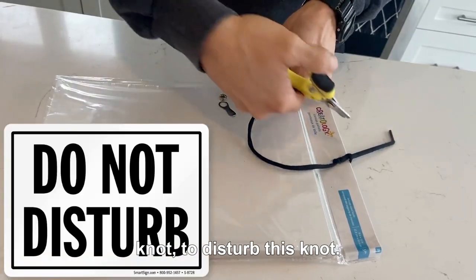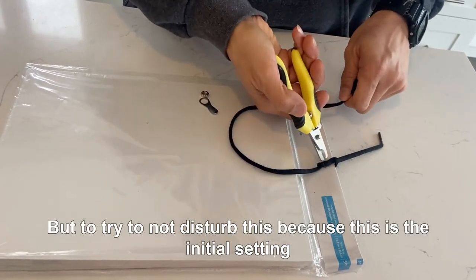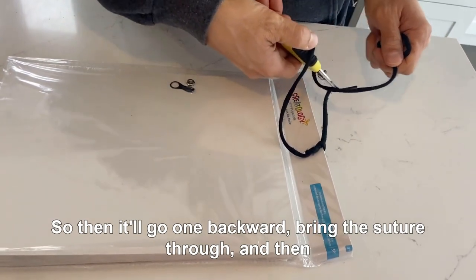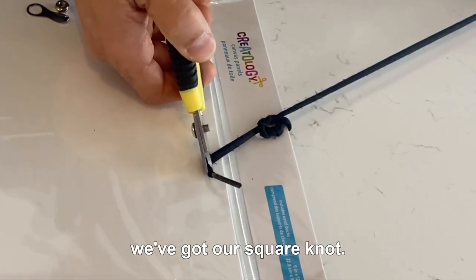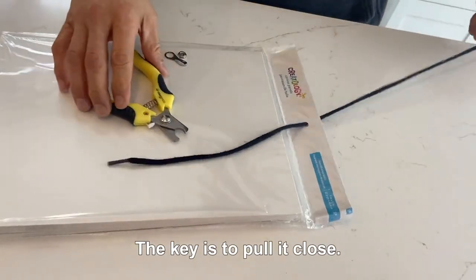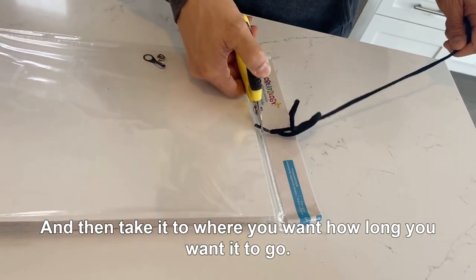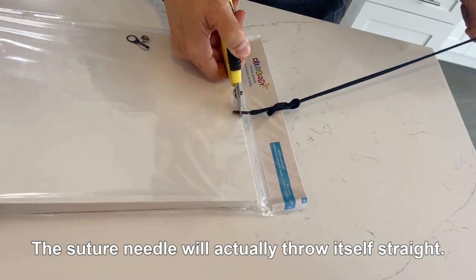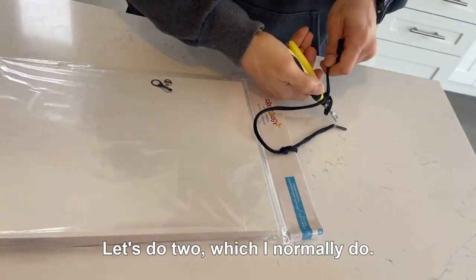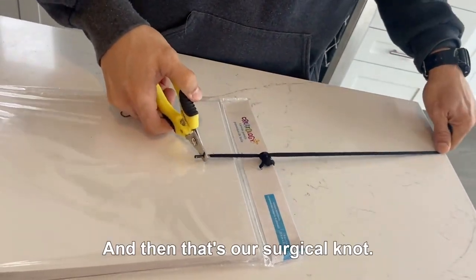What I've noticed is I need to pull it tight for this to finally run flat. The key is to try not to disturb this knot when you're suturing — it's easier on a table with a skate lace but really difficult in the mouth. This is the initial setting knot — opposite of my initial throw — so I go one backward, bring the suture through, and there's our square knot. One of the most important tips I've learned: grab it right at the end and take it to where you want it, and the suture needle will actually throw itself straight and flip across. Then do two reverse throws — and that's our surgical knot.